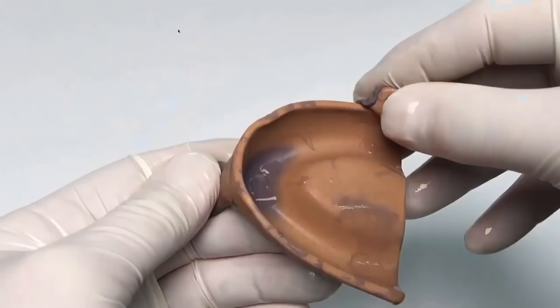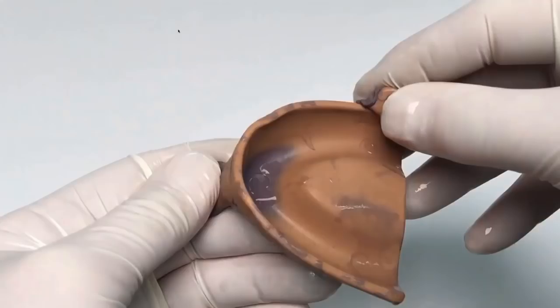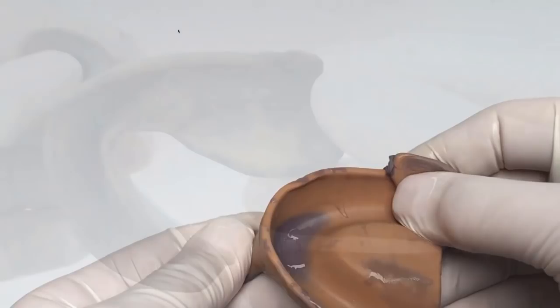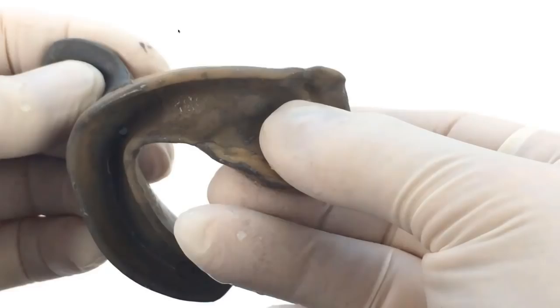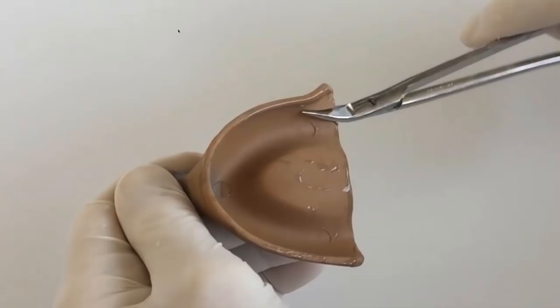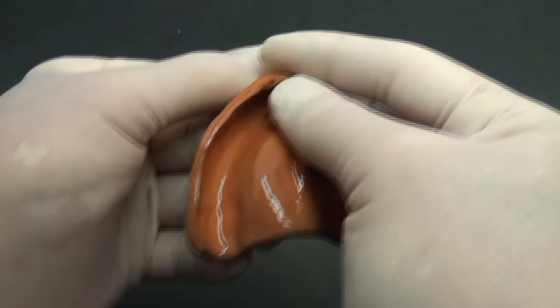If the tray can't be stretched because there's just too much distance, take the extra gumstick material and add to it. You can do the same on the lower — one area you commonly miss is not getting into the retromylohyoid area, and this tray allows you to do so. If the tray is too big for a small mouth, take the warm tray and trim it with Dean scissors. It cuts very easily and you can shape it, opening up frena and removing areas for border molding materials. After shaping, smooth it with your hands, then prepare it for the final impression.